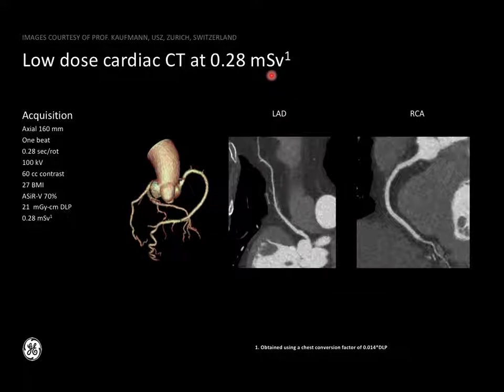So it's 1/10 of the radiation dose of the background. So you're now making pictures that are well below background radiation. And so you will never be able to do an experiment to determine if that causes cancer. You just can't. Because the signal would be so small, you'd need like 9 billion people to show a difference, right? So it's going to be way down.